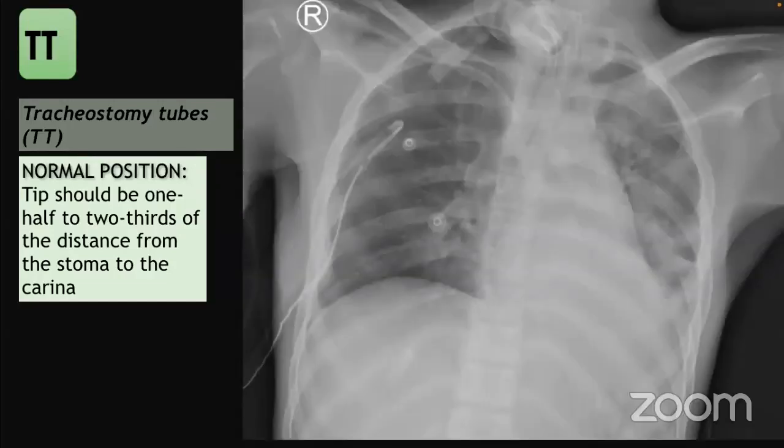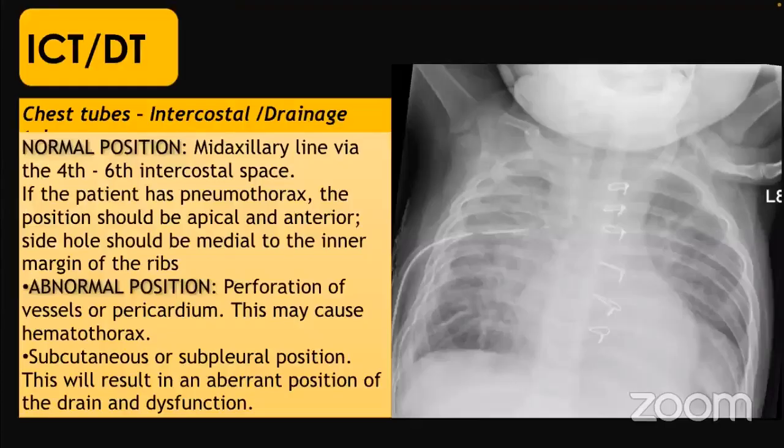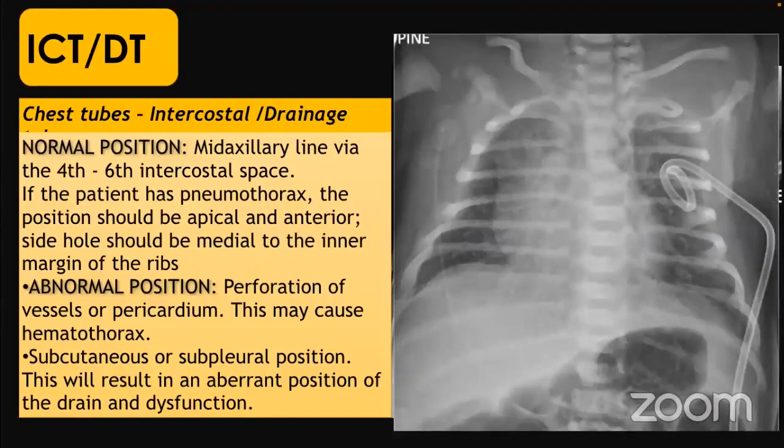Okay, we have here another tracheostomy tube. It's seen at a low position.